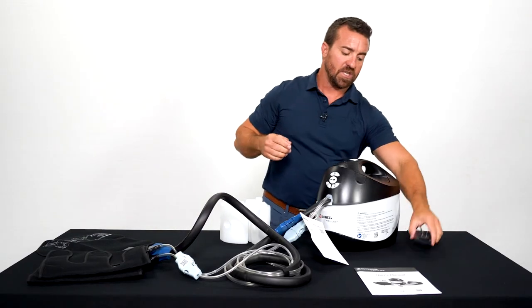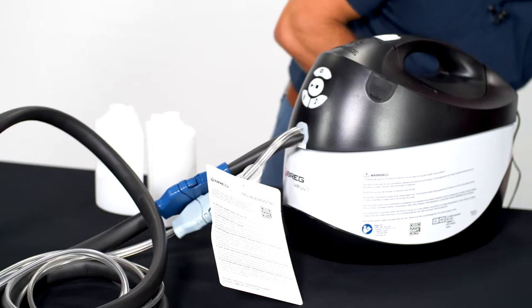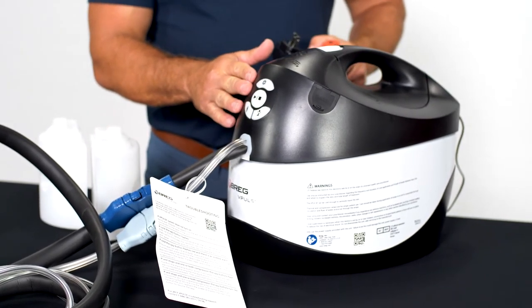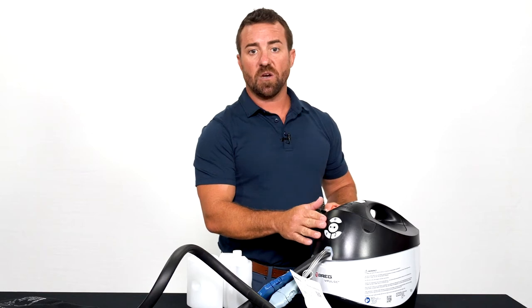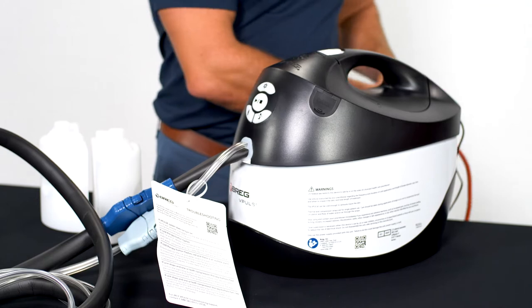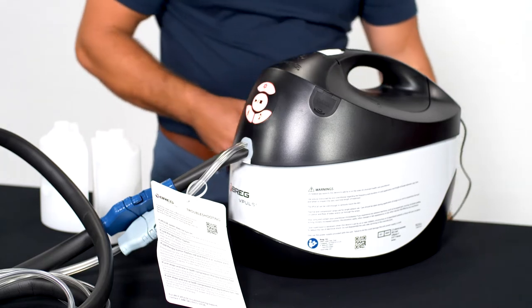Now plug your machine in. When we plug the machine in we're going to see a series of lights and hear a series of beeps. Once we hear those beeps we know the machine is ready for use. There's our beep — we're now ready.